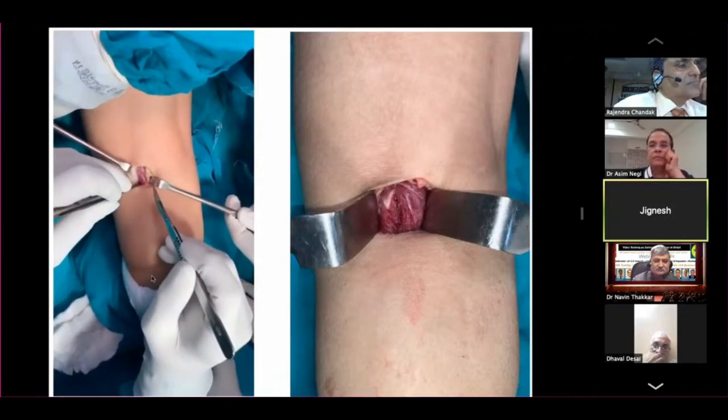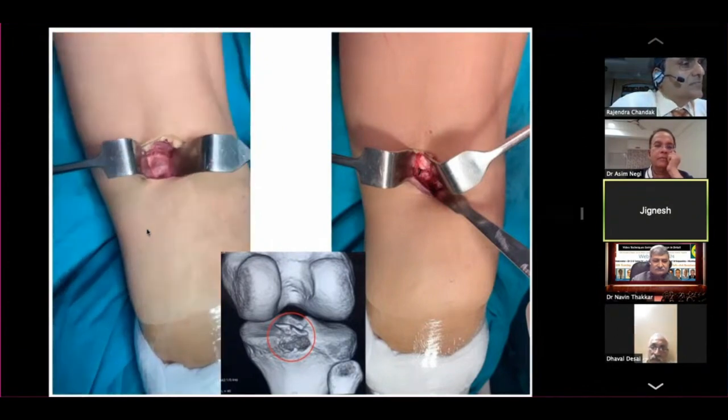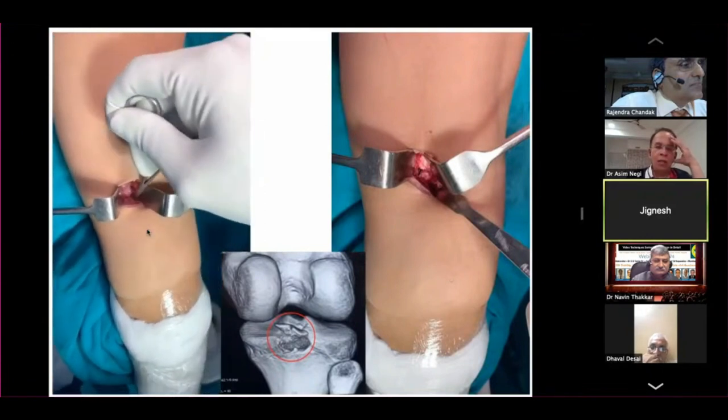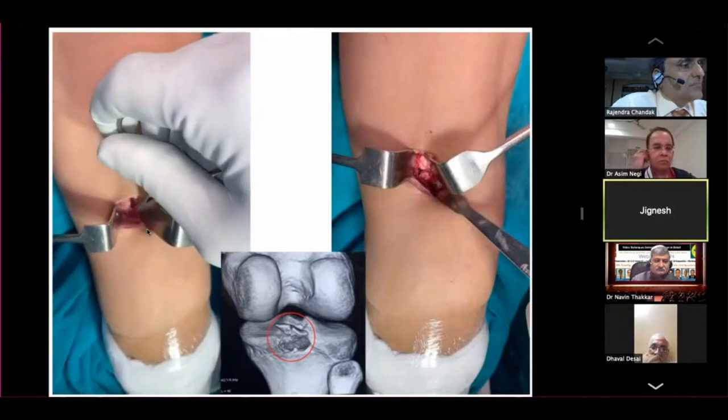In the next picture you can see there is a split between two fibers. You can just split the fibers with your finger only — just around your index finger and you will be able to reach there. Once both heads of the gastrocnemius are retracted, we can see the popliteal fascia. Both heads are split and retracted, and my artery forceps is palpating the fragment.